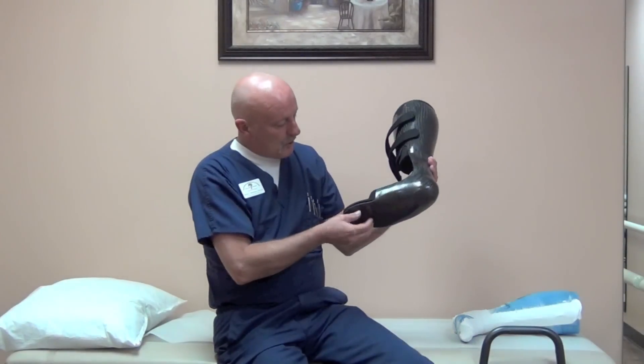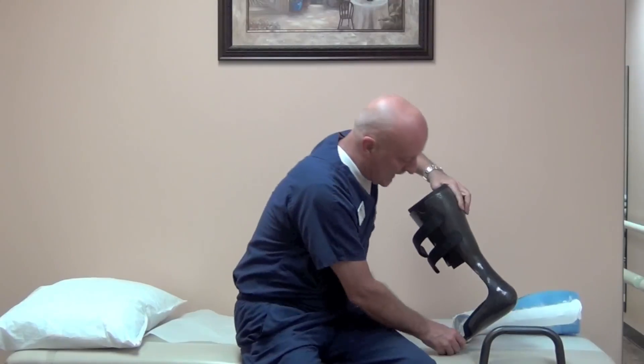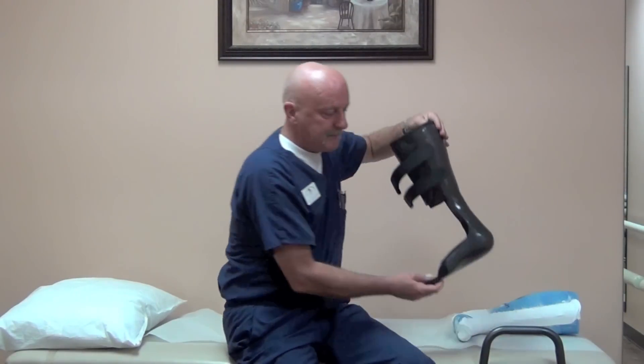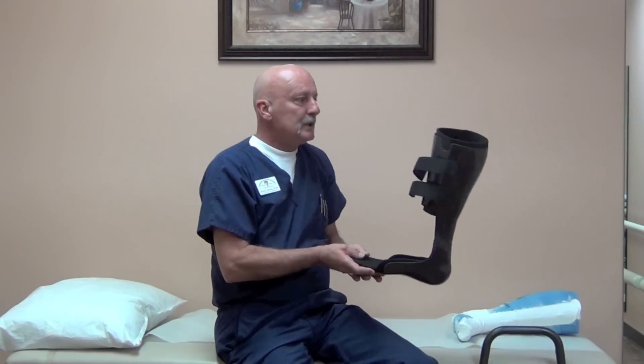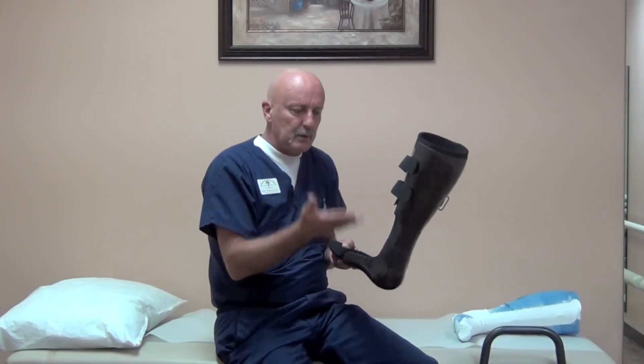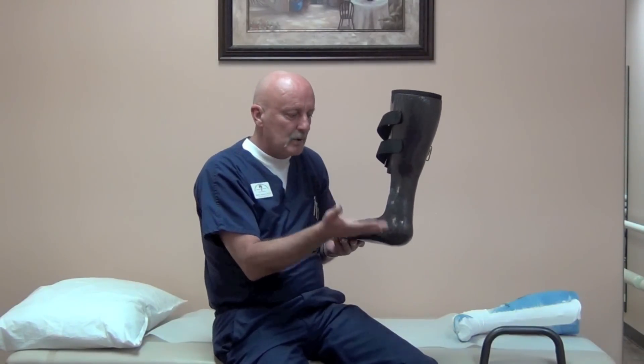The toe plate is also rigid but will have some flex for a little bit of energy storing properties, though more often than not it's basically left rigid. So if you have patients where you need to unload 100% of the weight through the distal tibia, talus, or calcaneus, this is a design that's acceptable.